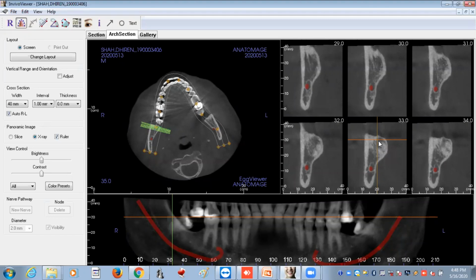So this is a small presentation of a basic software understanding. These things can be used for any software apart from this also. So here I'm ending my presentation.